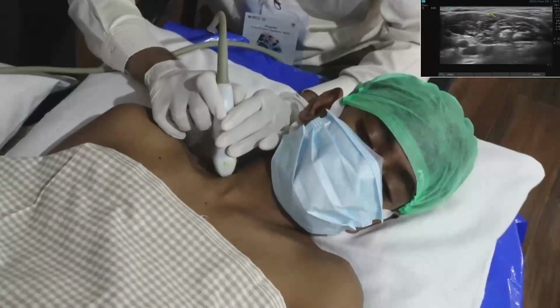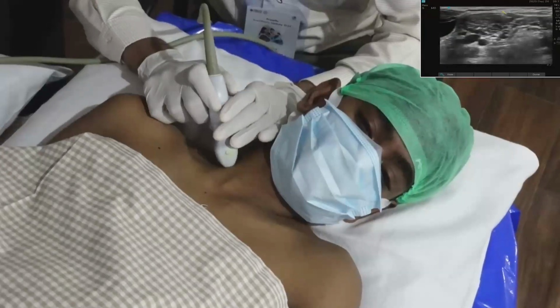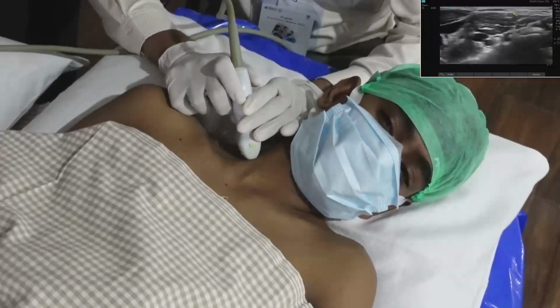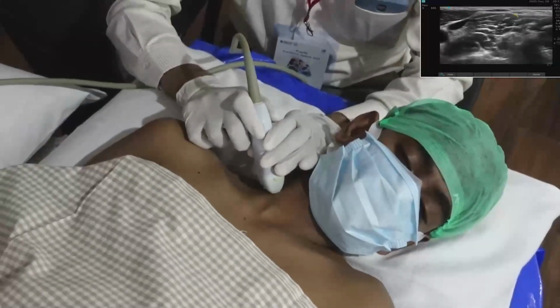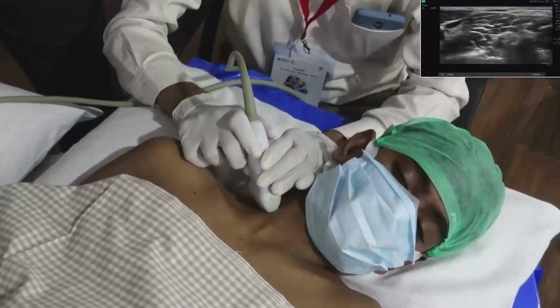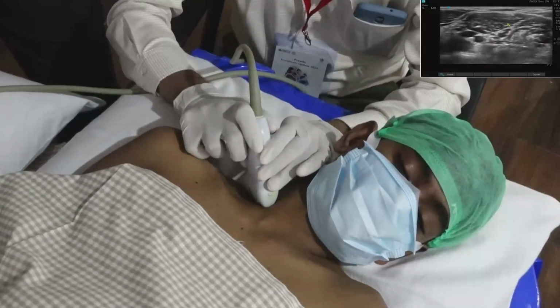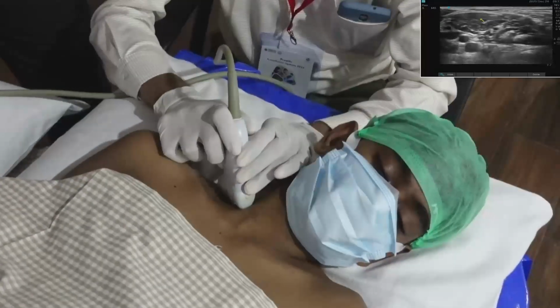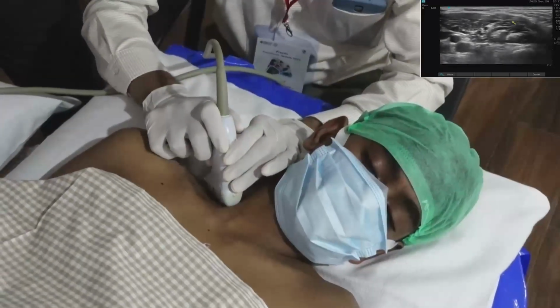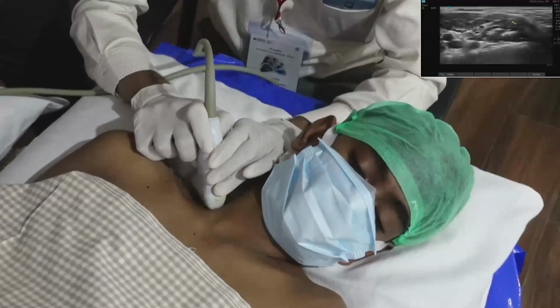So just after finishing upper trunk, I will come to this other, again proximal area where we see the interscalene, where we give the interscalene block. We have to look again for the two important muscles, that is the anterior scalene and middle scalene. In the middle scalene, you have to see the middle scalene substance carefully.